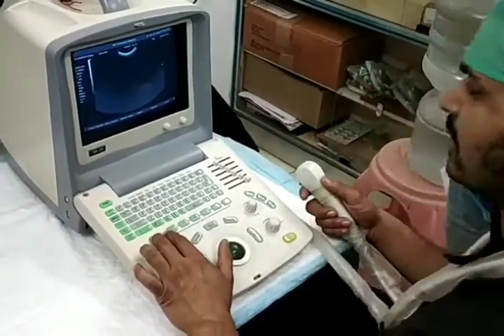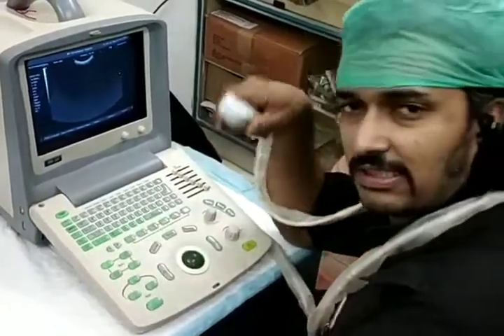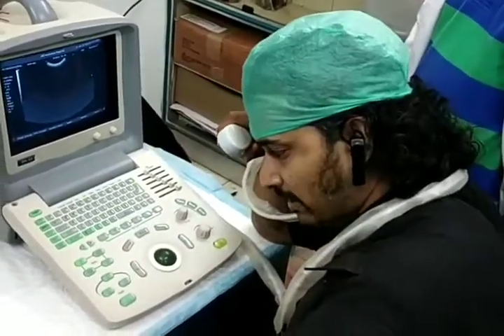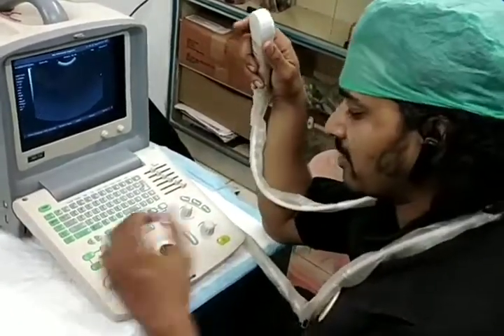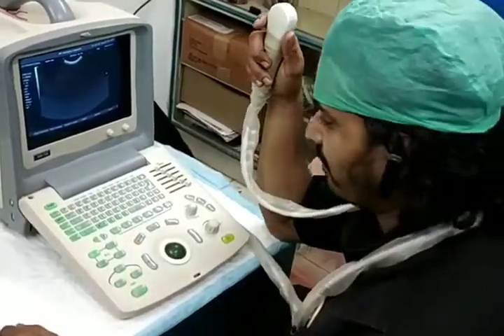and focus. So it is overwhelming when we see that there are so many settings and so many buttons over here, but to be very honest, we need very few of them, and the more we play with the machine, the more we get familiar with them.